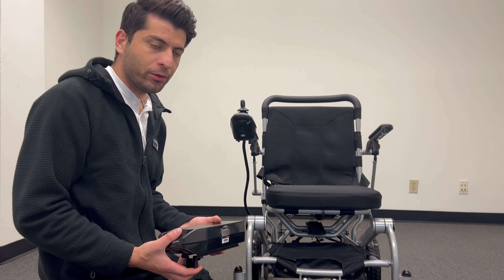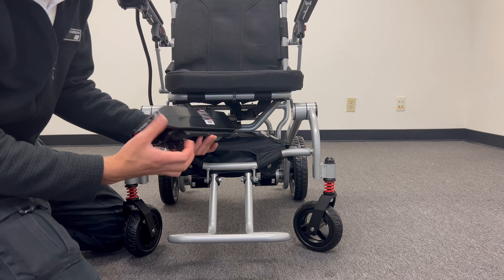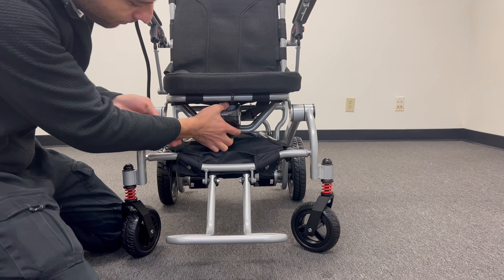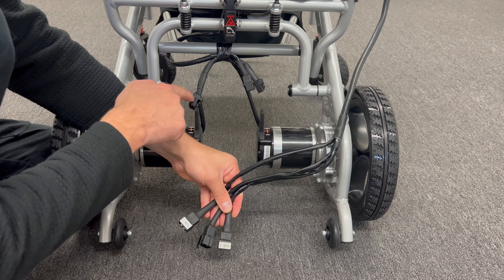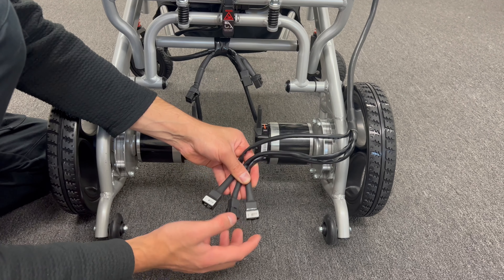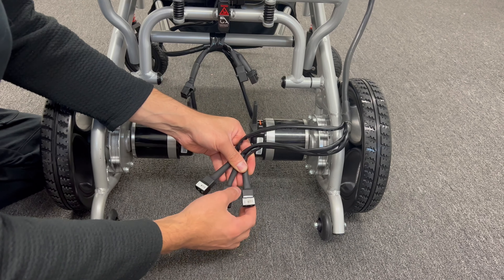Let me show you how to place the battery on the wheelchair. Before you put it there, you need to hold right here to the back and then just gently. After we put the battery, I will place the joystick cables on the wheelchair and show you which cables go where. Here is the right motor, the left one, and this is the battery cable.